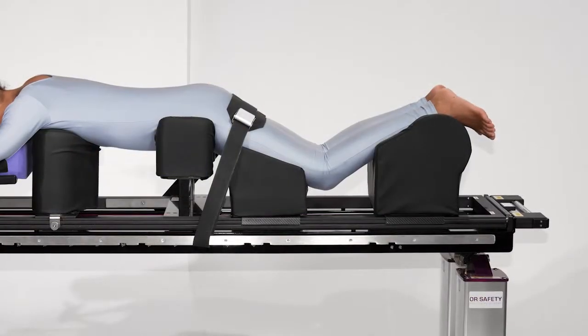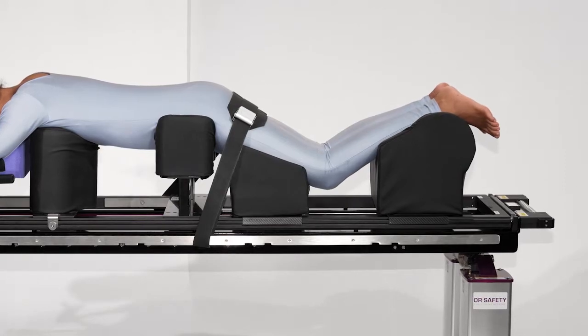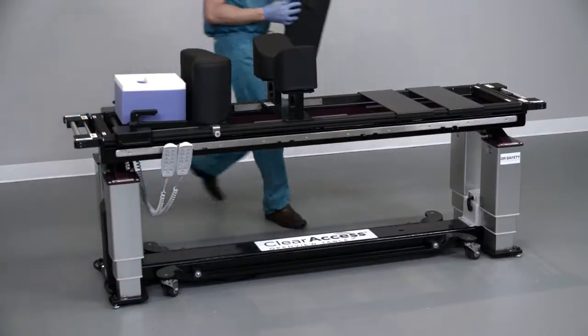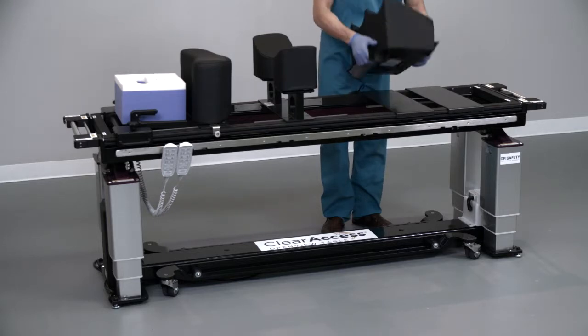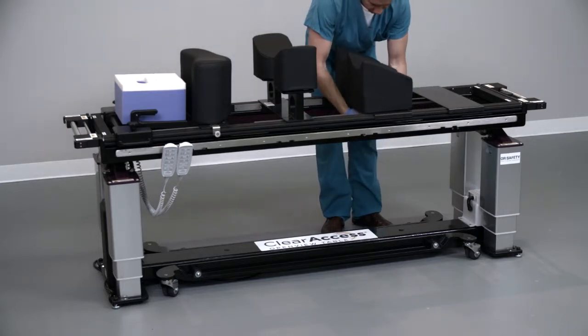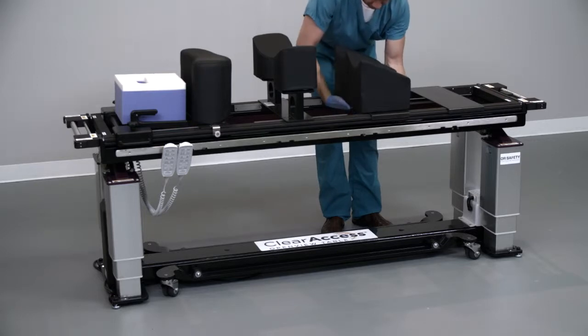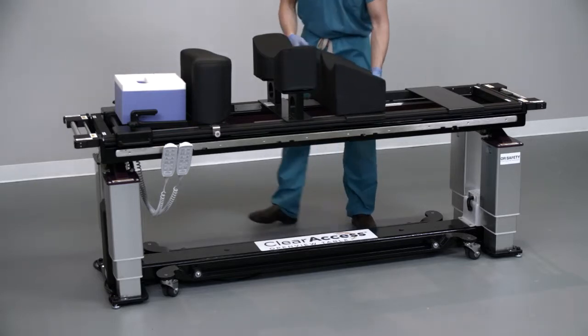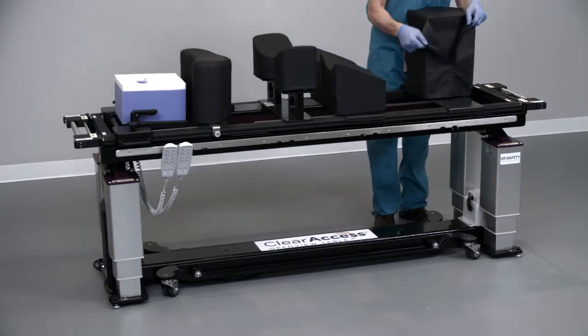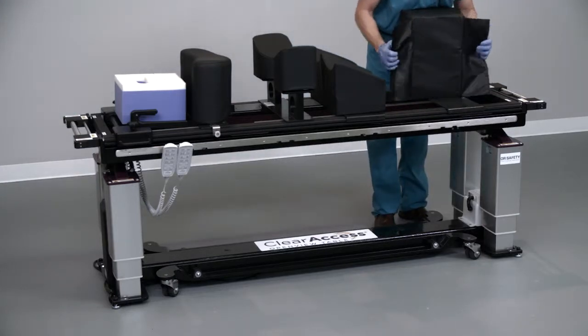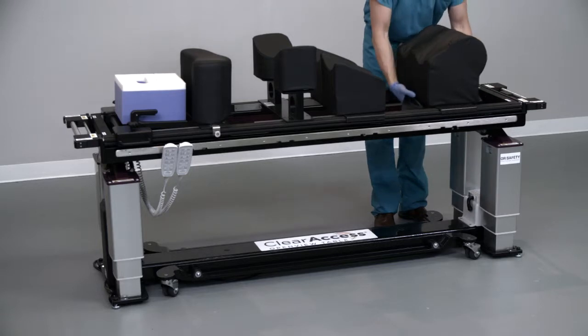The leg management system includes a thigh pad and an ankle rest. Install the thigh pad on the carbon fiber support closest to the open frame by wrapping the flaps of the pad around the support and joining the velcro underneath. Adjust the placement of the pad as necessary by sliding it toward the head or foot end of the table. Repeat the installation procedure with the ankle rest on the carbon fiber support closest to the foot end of the table.